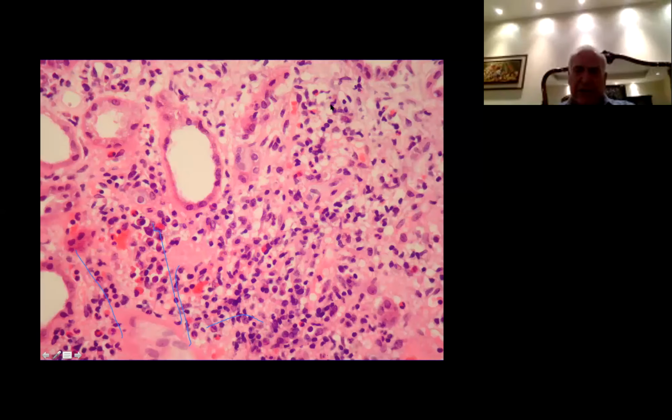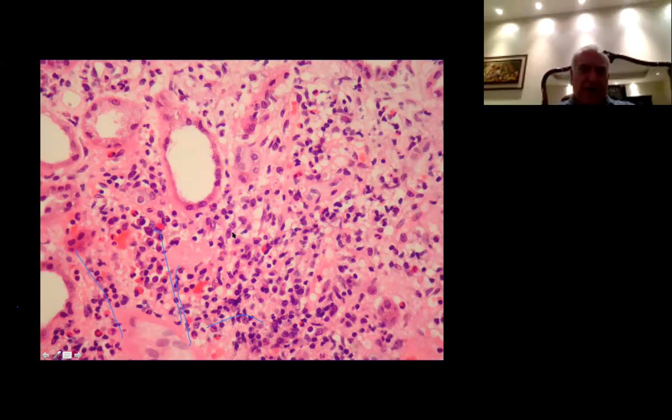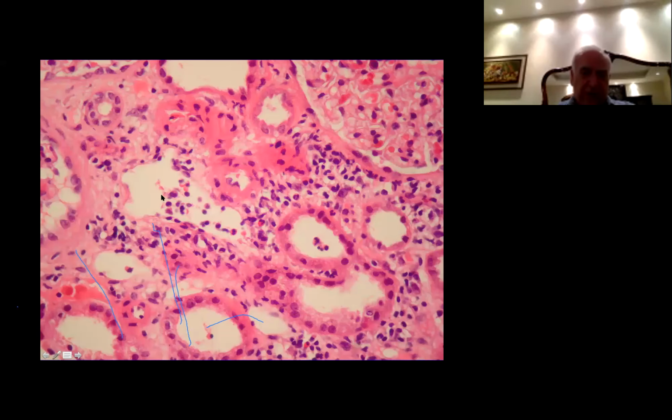Large area of interstitial infiltrate. There is an eosinophil, eosinophil, eosinophil. It's a really good number of eosinophils in the specimen. Not only that, but you see some eosinophils in the renal tubules. If you have it there, I think ideally we should catch it in the urine, but unfortunately, the urine sample was negative for it.